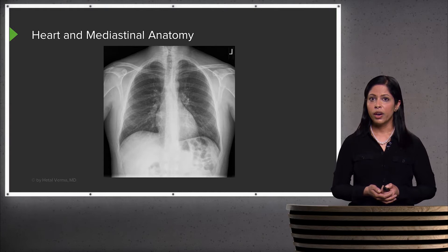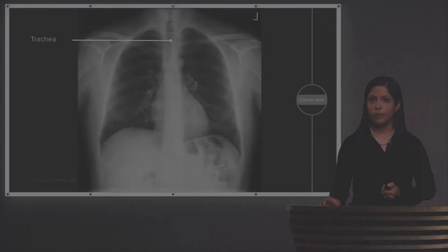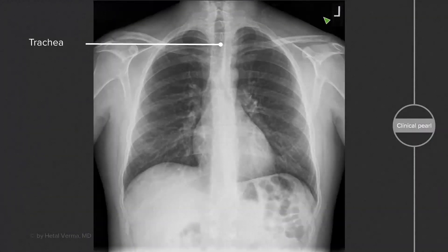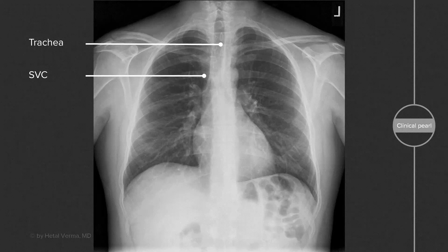So let's start first with heart and mediastinal anatomy. We take a look at the trachea, which again should be midline, and it's the air-filled structure within the mediastinum. We then take a look at the shadow of the SVC, or the superior vena cava, and that's seen just to the right of the mediastinum. You can see it pointed out here, and you can see the shadow coming down this way.